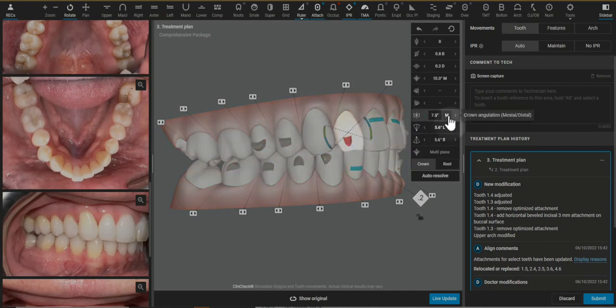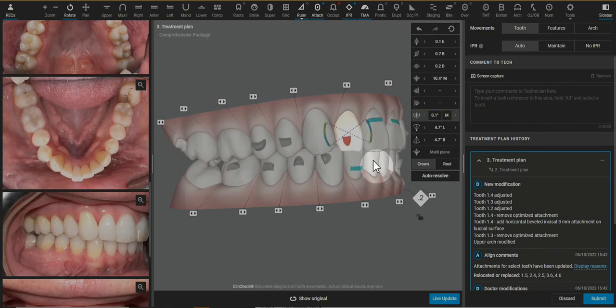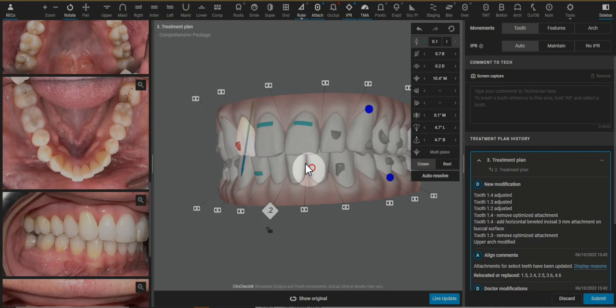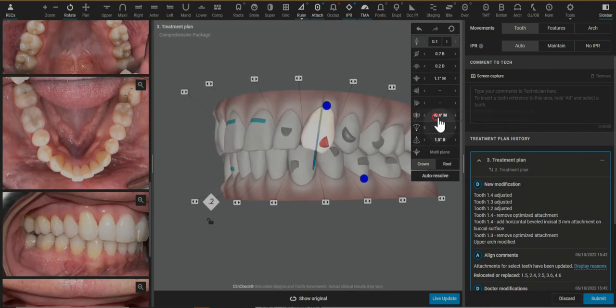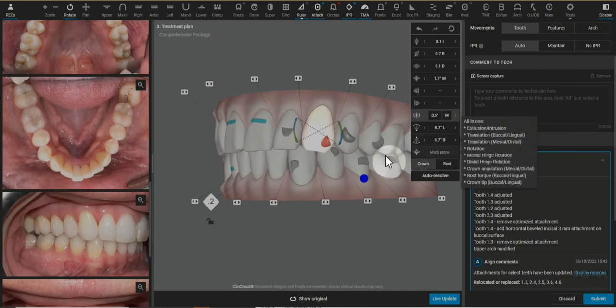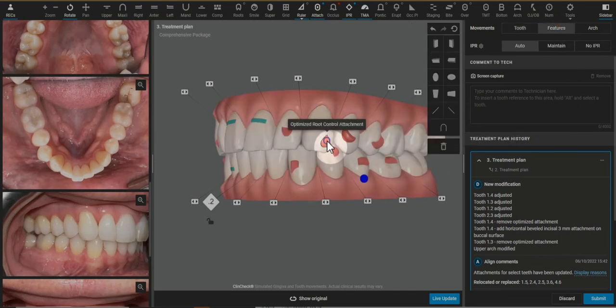I'm going to do the same type of thing with the lateral and eliminate that movement. And again, eliminate extrusion on a deep bite case.